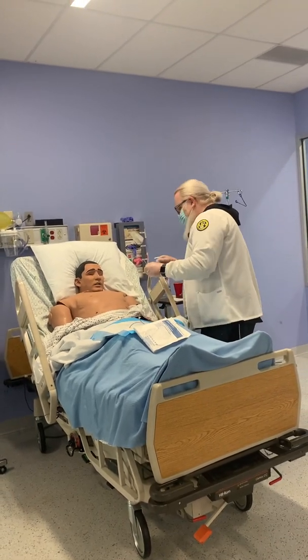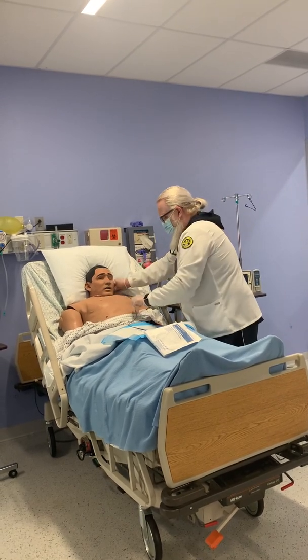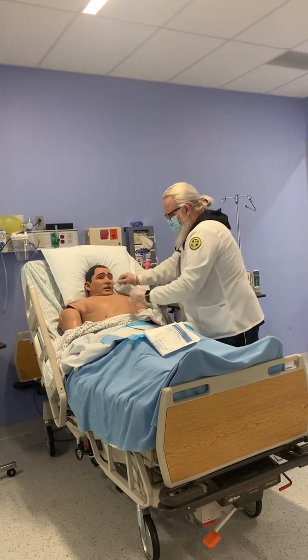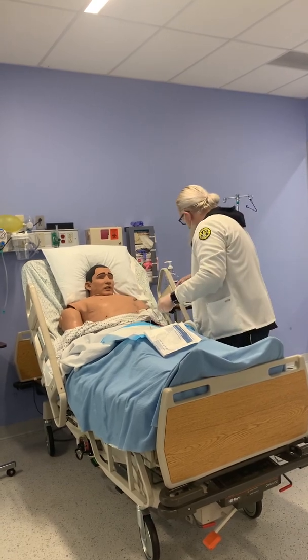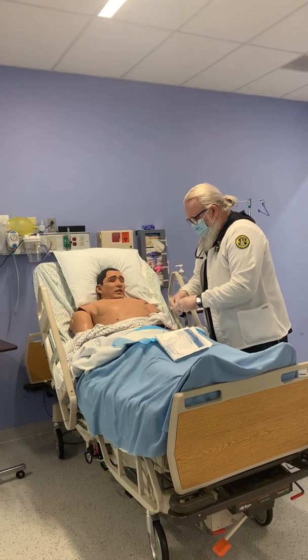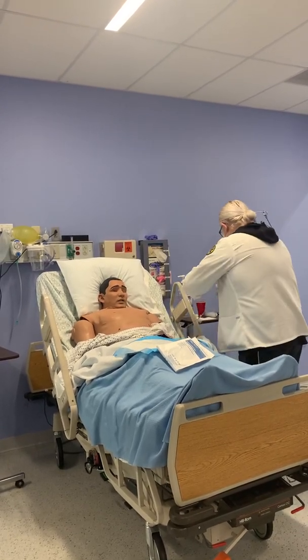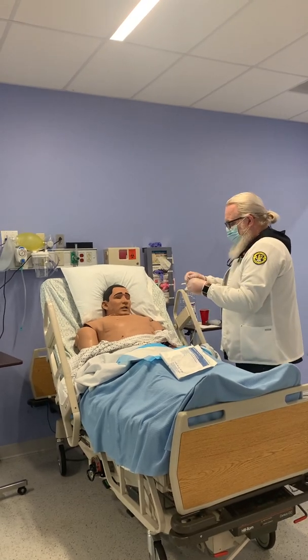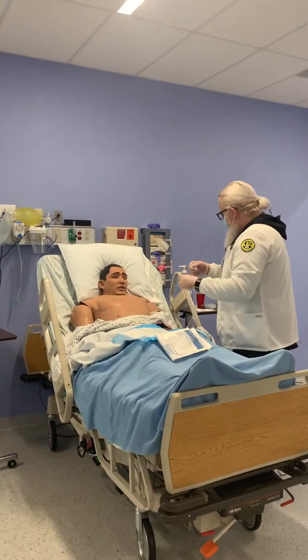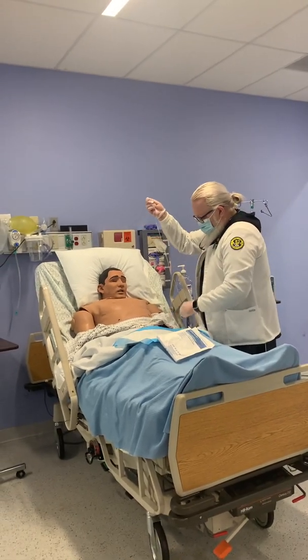What I'm going to do is again measure from the nose to the earlobe to the xiphoid process. Have a piece of tape here. I'm going to wrap around so that we know that we're all the way in. Next I'm going to get some lubrication, 3 inches worth of lubrication, okay? And we're going to insert it into your left nostril, all right?